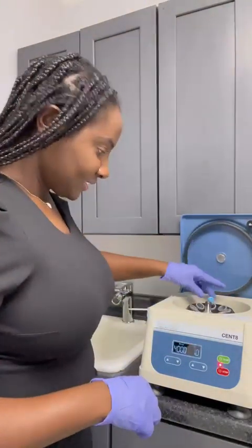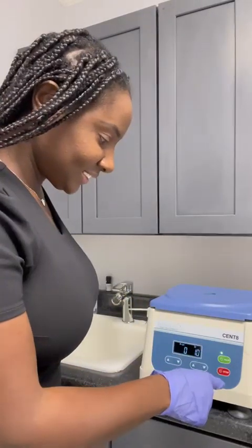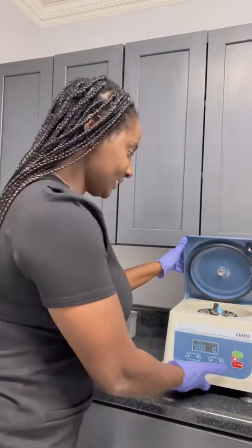I have drawn the client's blood already and now I'm going to place the blood inside the Juventix centrifuge machine and let it spin for 10 minutes. In 10 minutes I will have the plasma from the client's blood.